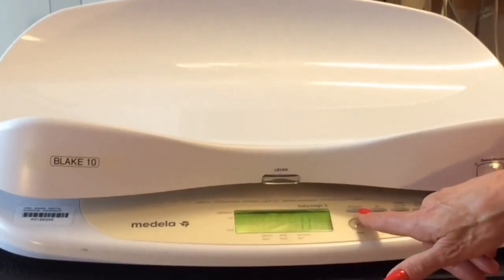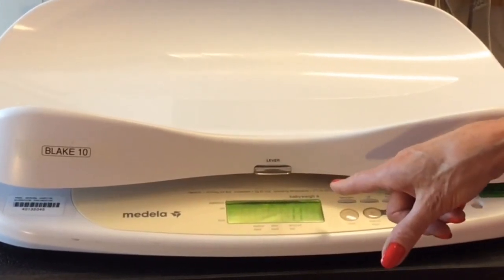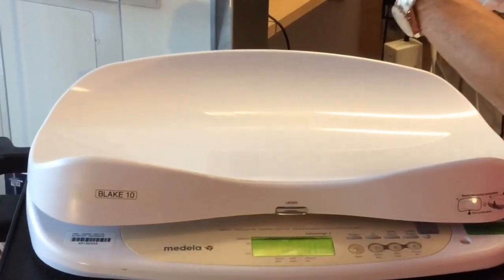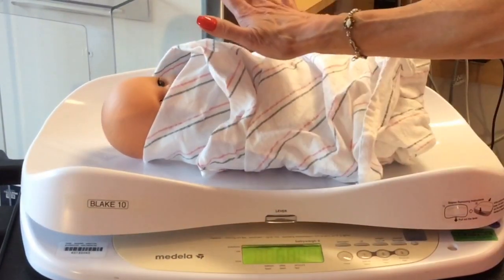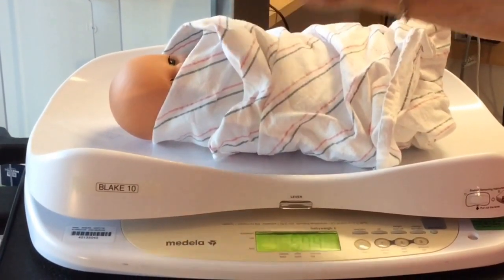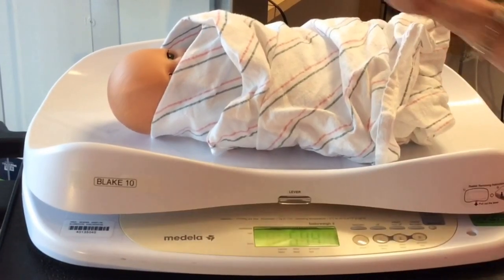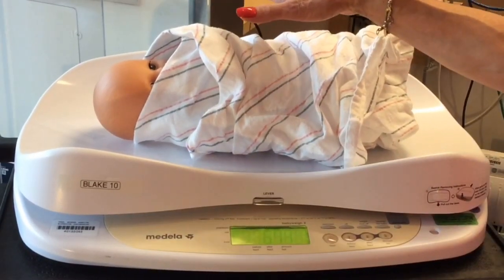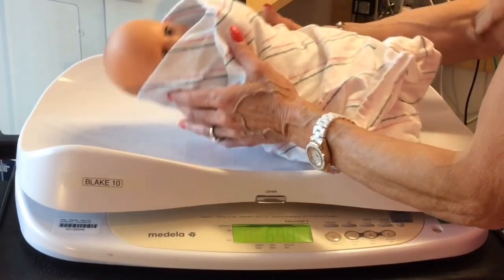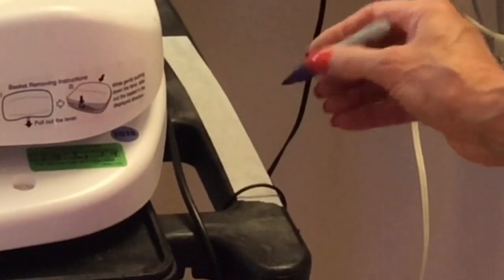Swaddle the baby. Press the button on and wait to see the zero appear in the display. Place the infant on the scale holding one hand over the baby. Then you wait until the display indicates lock. You're going to press 1 to store the pre-weight. Then remove the infant from the scale and write down the pre-weight.